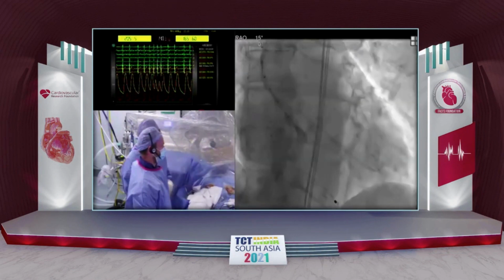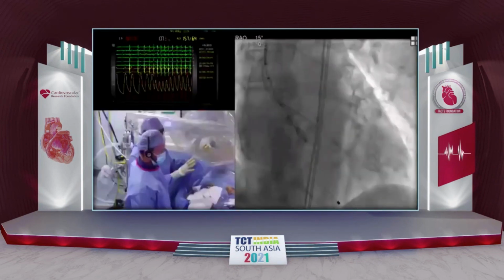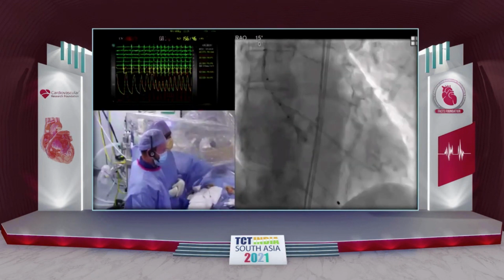Next image, please. Can I ask you a quick question? Absolutely. So I'm going to stop then. Question to panelists and to the chairs, please. Sorry, just a quick question on the pre-dilatation. Do you do that routinely with Navitor, or is this based on this patient anatomy?